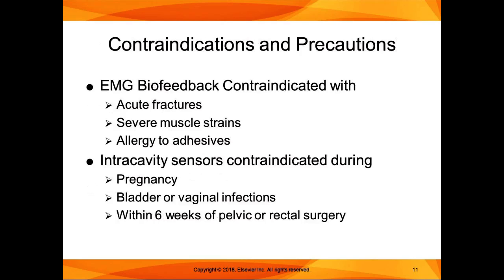So contraindications and precautions. You don't want to use EMG biofeedback with something where a muscle contraction is going to cause a problem: acute fractures, severe muscle strains. The third contraindication is if someone's allergic to the adhesives that you need to use to put the electrodes on. So those are the contraindications. For the intracavity sensors, they are contraindicated during pregnancy, bladder or vaginal infections, or within 6 weeks of pelvic or rectal surgery.